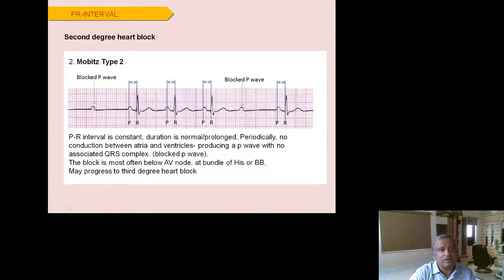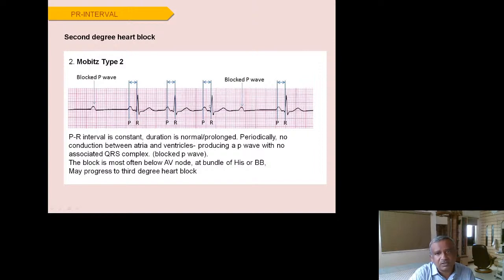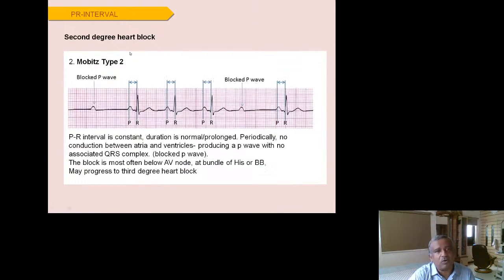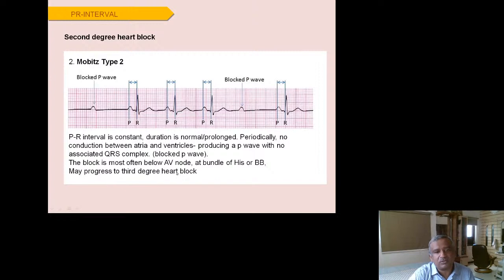Mobitz type 2: the PR interval is constant — normal or prolonged — but periodically there is a P wave with no following QRS. Unlike Wenckebach, the PR interval does not lengthen progressively. Mobitz type 2 is more serious because it always has the potential to progress to complete heart block very quickly — the block is below the AV node, at the bundle of His. It must always be taken seriously clinically.